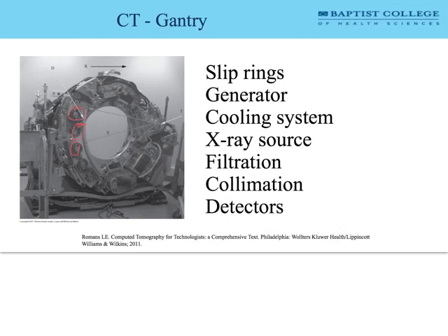And specifically, it tells us just how rugged this scanner is. How rough and tumble is it? Is it something that's going to be a good workhorse for my hospital and get a lot of work done? Or is it like a fancy, high-end CT scanner where I'm going to have to replace the tube every 6 months or something?